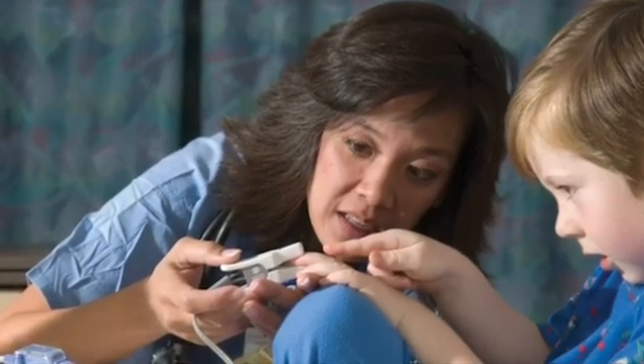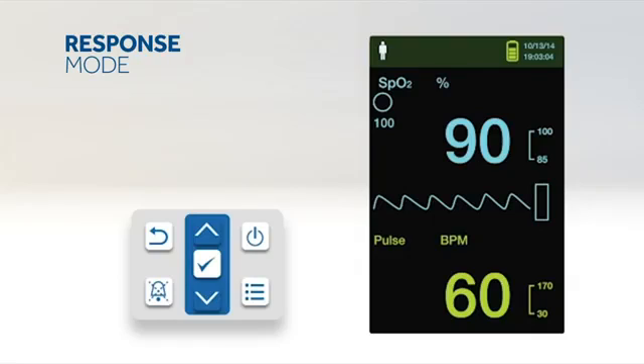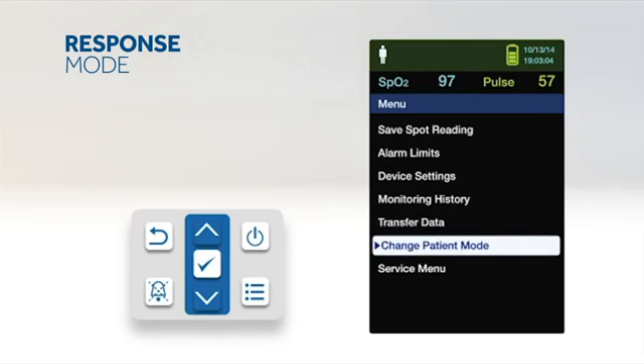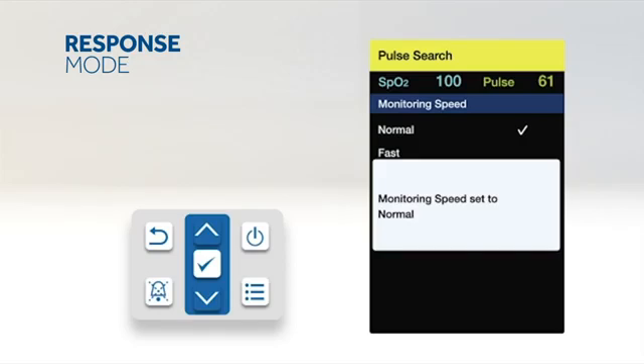The monitor has the added functionality of response mode, home care mode, and sleep study mode for simplified monitoring in hospital and home settings. Response mode establishes the rate that the monitoring system responds to changes in SpO2 readings. To set the response mode, access the change patient mode menu, press up or down to highlight the response mode menu, and press OK to select. Press up or down to highlight normal or fast, then press OK to confirm. When set to normal, changes in blood oxygen saturation are reported within 5 to 7 seconds; when set to fast, within 2 to 4 seconds.